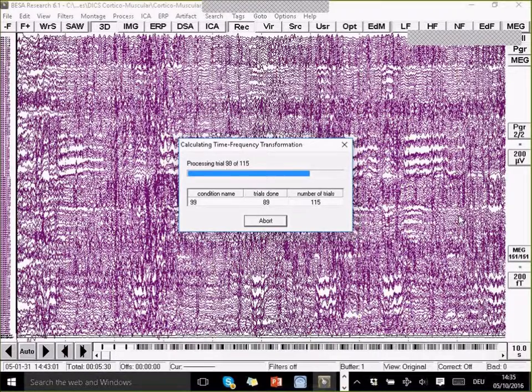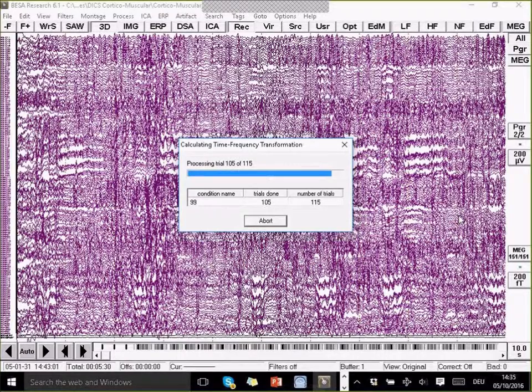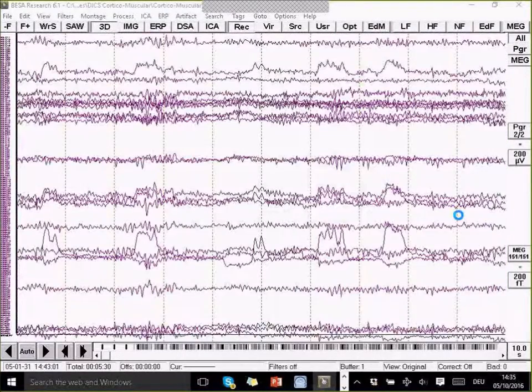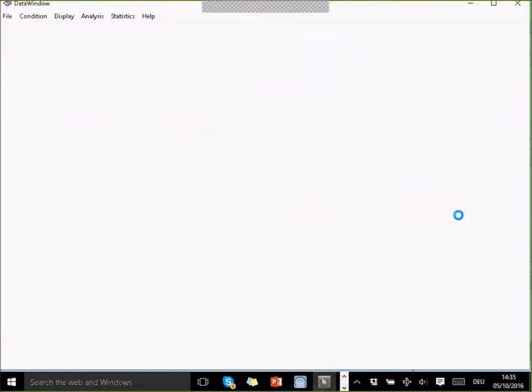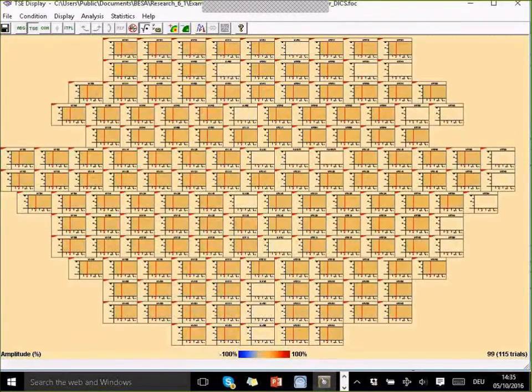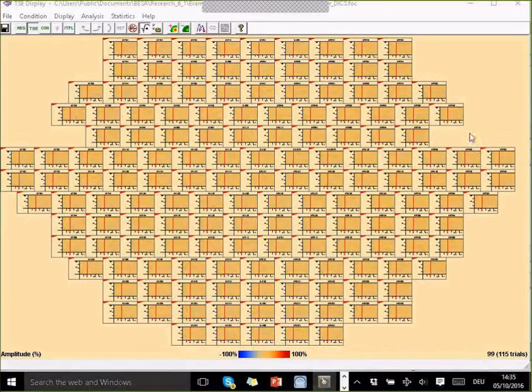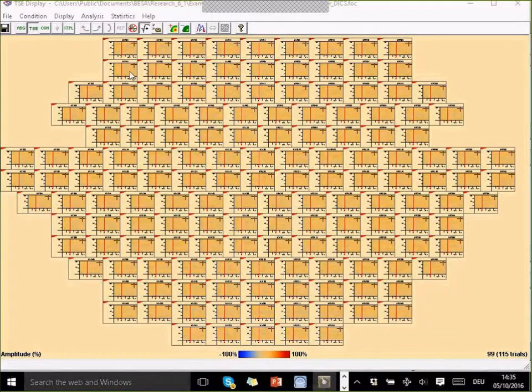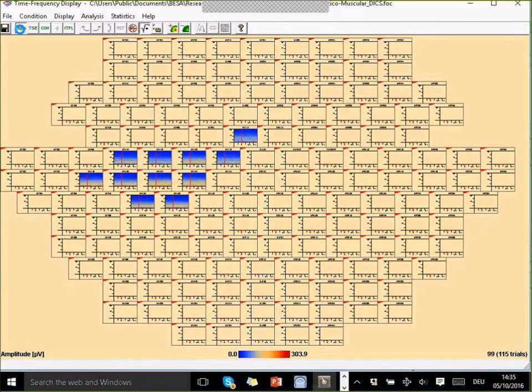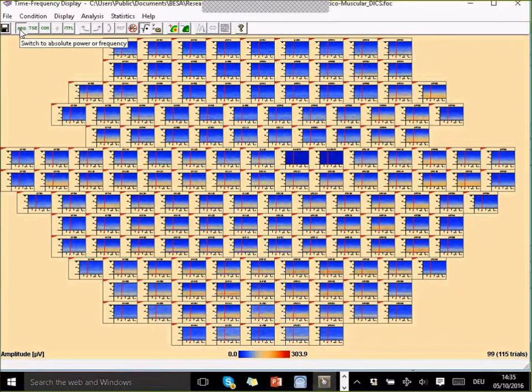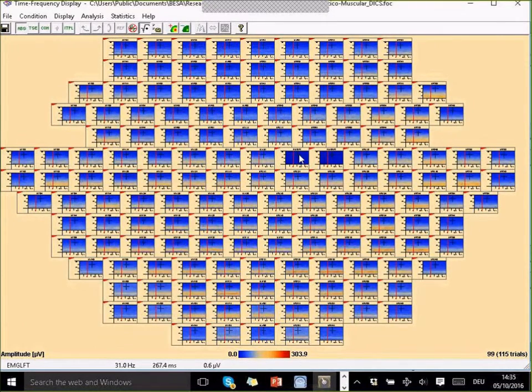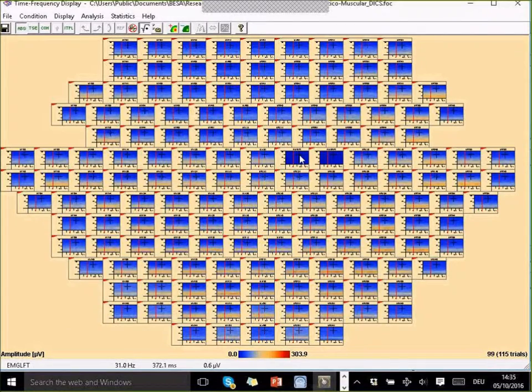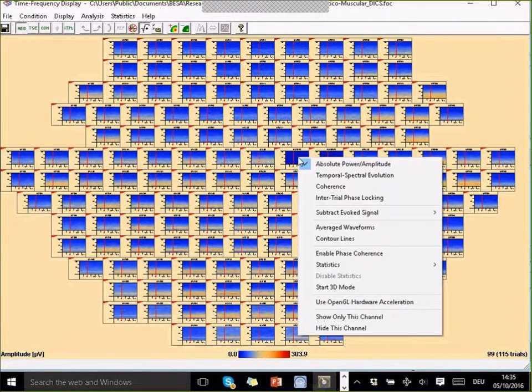After we get the time-frequency activation finished, we've got many channels now to show in our time-frequency diagram because it always works in the currently selected montage. I just want to show the absolute rather than the difference to the baseline. I'm going to show the absolute power. And I'm just going to concentrate now on the EMG channel. So I'm right-clicking and show only this channel.